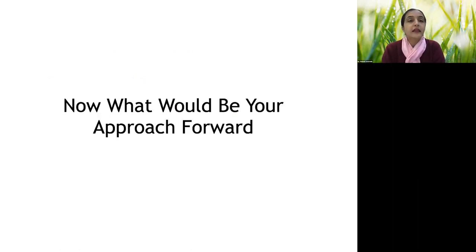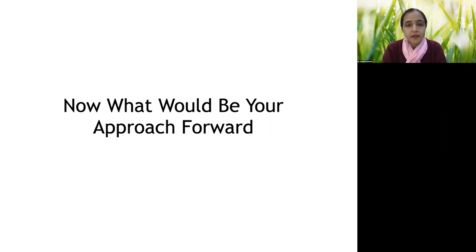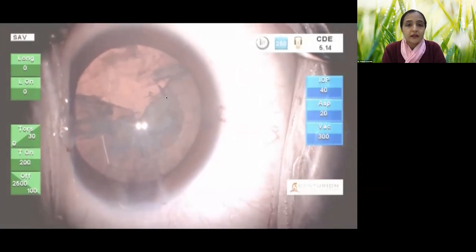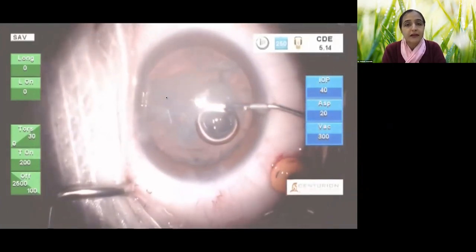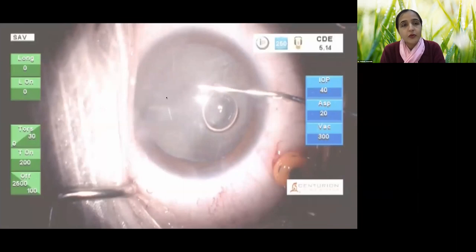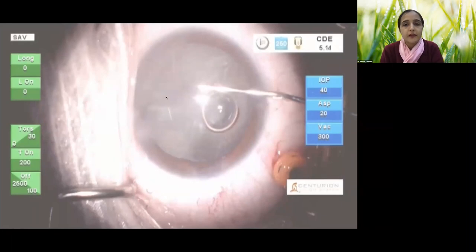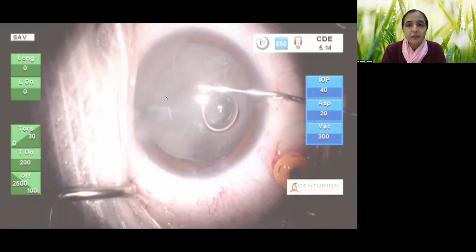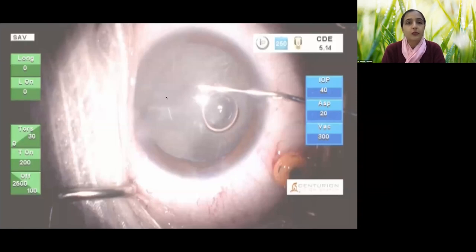Now, how do you move forward? You have a PCR, half the nucleus is still inside the capsular bag, and there's no obvious vitreous in the anterior chamber. The best thing — as also shown by Dr. Hirapriya and Dr. Prashant — is to inject good viscoelastic, ideally dispersive, and then only come out of the eye. The next useful step is to inject preservative-free triamcinolone acetonide — about 0.1 ml through the side port — to help visualize vitreous.